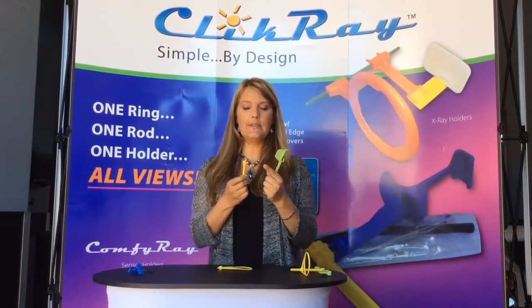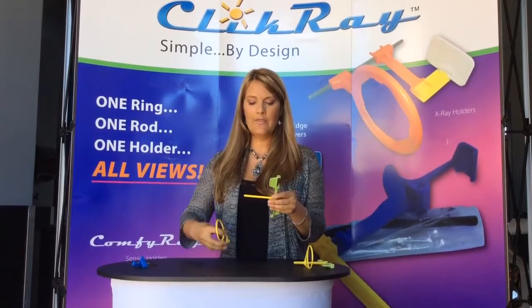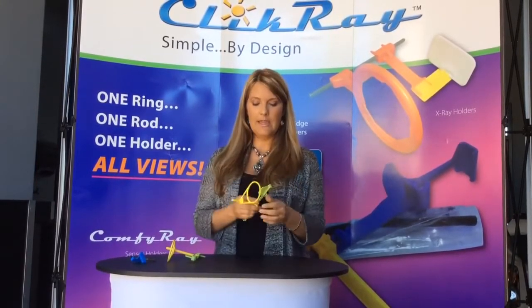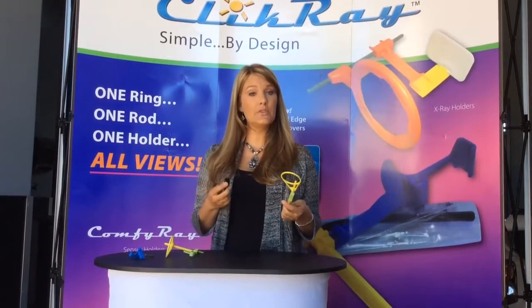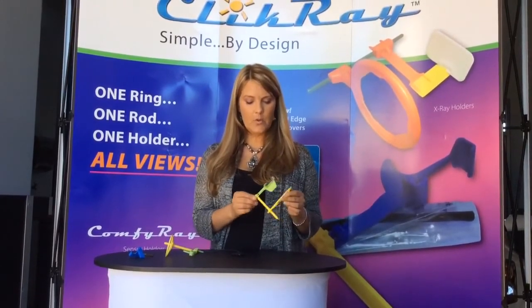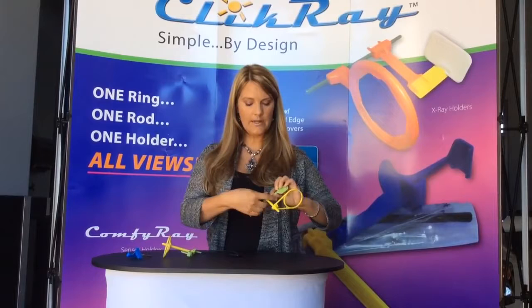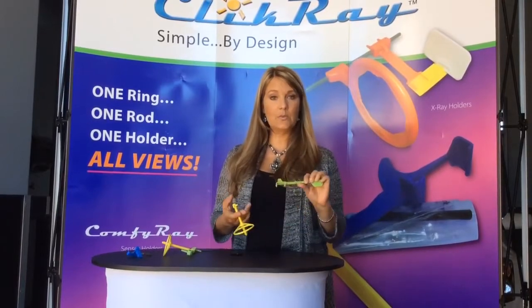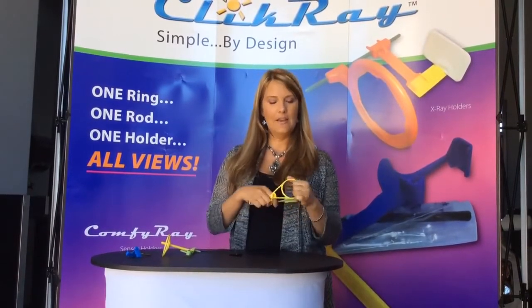So what we're gonna do to assemble this is we have a small pin on the end of the rod, and we're gonna slide this into the middle hole on the holder, and then we're gonna slide our ring directly onto the rod. You will notice that this ring clicks into three positions: high, medium, and low. And just for today's demonstration, we're actually not going to be using a sensor sleeve. One of the other things you're gonna want to keep in mind here is that X marks the spot. We have a little X right on the rod, and it's important to keep your thumb on that, because if you don't and you're moving this rod, one of the biggest learning curves is this will actually pop out. So just put that in the middle, put your thumb on it, and hold it while you're making your adjustments.